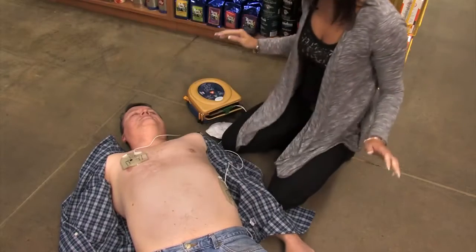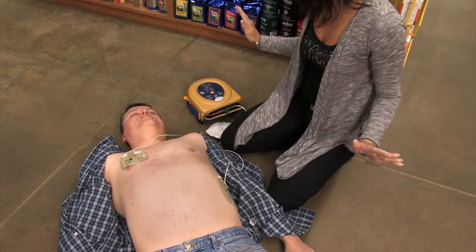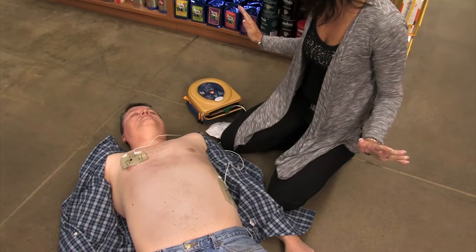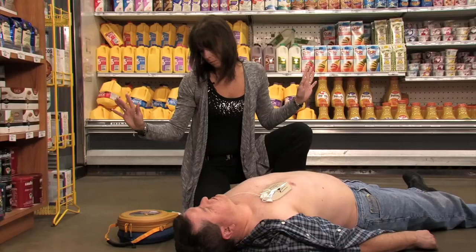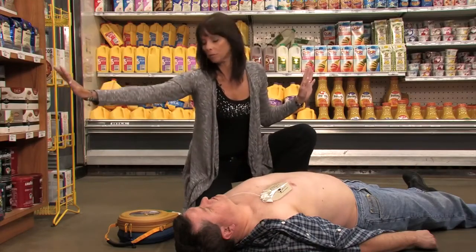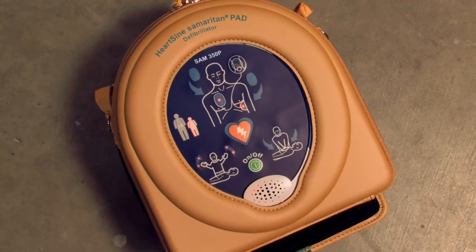Stop CPR. Assessing heart rhythm. Do not touch the patient. Stand clear of patient. Shock advised. Stand clear of patient. Press the orange shock button now. Shock delivered.